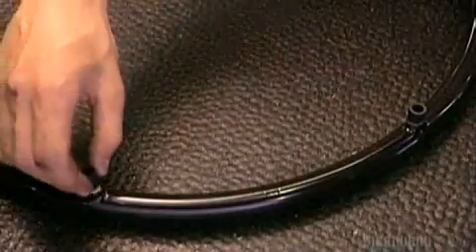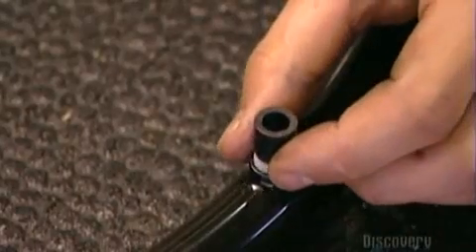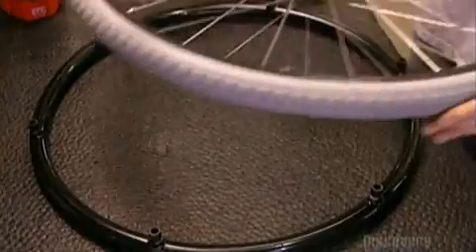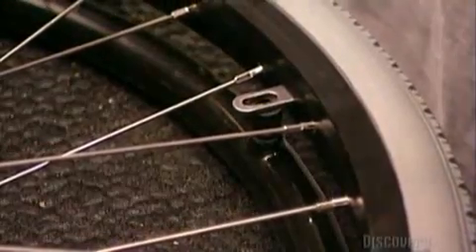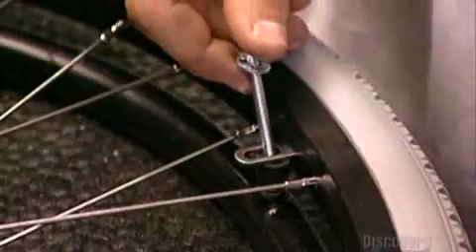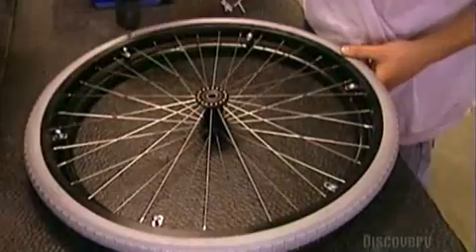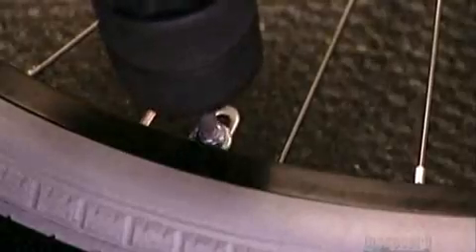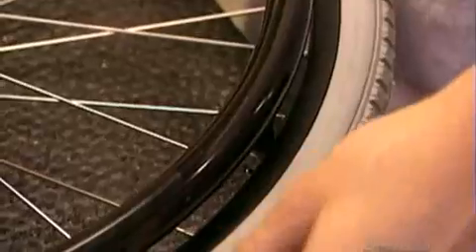Hand rim. 6 of these 1 centimeter spacers can be removed later to adjust the chair's overall width if necessary. The spacers on the hand rim align with the brackets on the wheel. Workers join them with industrial strength 4 centimeter steel screws. Replacing a wheel and hand rim like this costs more than $100. You buy replacement parts much like you do car parts through specialized dealerships.